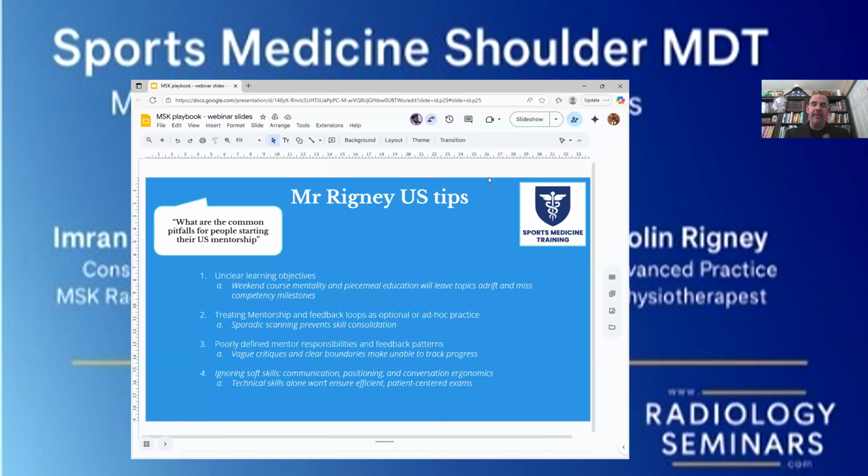Do they need an MRI? Do they need a referral to a specialist? What's your treatment recommendation? How are you going to explain those things? Doing it at the point of care with ultrasound gives you that opportunity, because they've already bought into your authority and your trust, because you can do this confidently at the bedside. Then it's just an easy lead into the next conversation if you develop this over time.